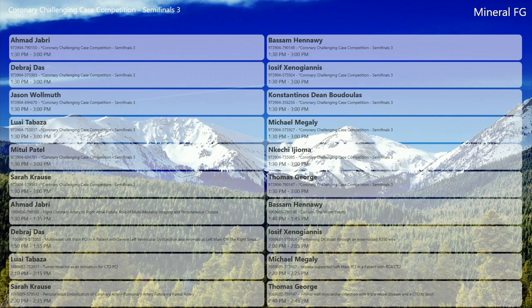Yeah, no, I think it's a really good recommendation. I just thought of it because it's more than likely the cause of why you don't have flow in your native vessel, but just in case there's something else going on, you just want to make sure. Maybe you have an ostial dissection, a guide-induced dissection, something like that, and then here you are sacrificing the vein graft. So it's probably an unnecessary step in most cases when you're coiling.